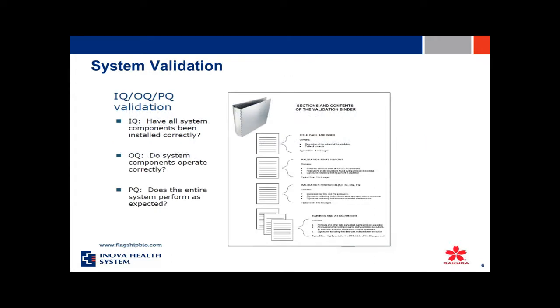Before we talk about any system validation, I think there are some basic rules here. Most of you might be aware of these system validations, which are called the IQ, OQ, PQ protocols. The IQ is the installation qualification, which means have all the components been installed correctly. For example, when we're talking about an imaging system, how is your cable connection? How is your scan scope stage? How is your autoloader functioning? Is your workstation operational? Is your monitor functional? And so on and so forth. So basically all those installation components have to be checked.